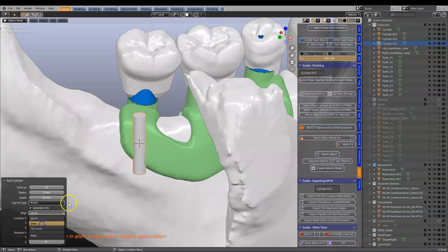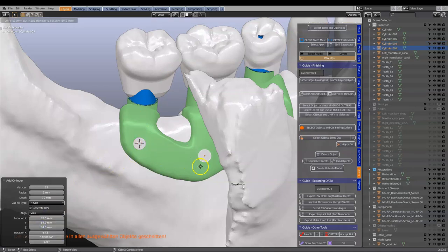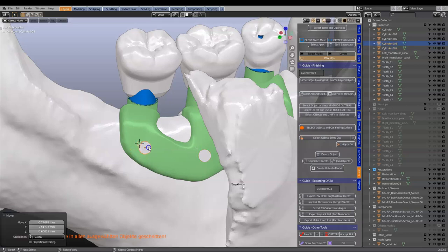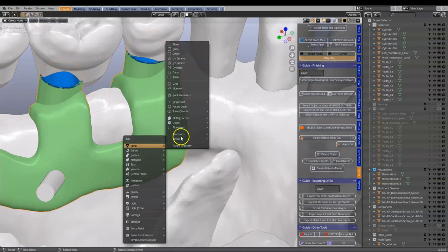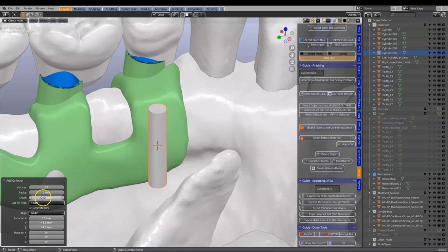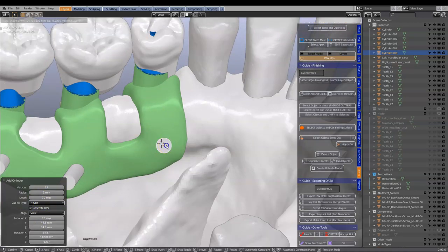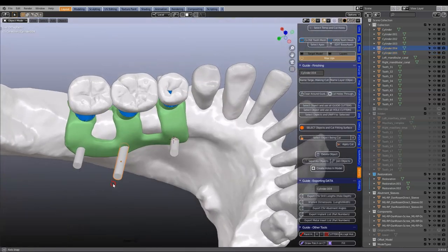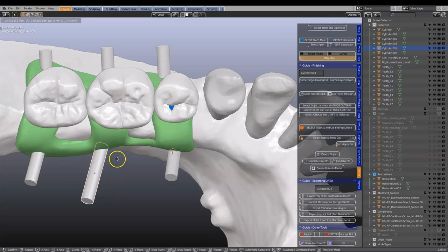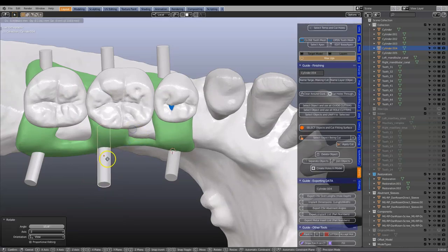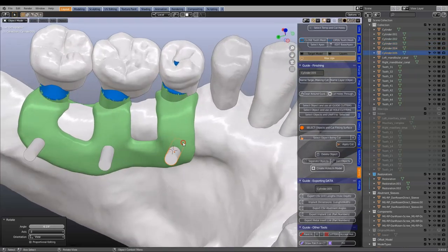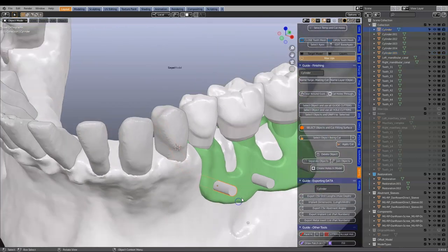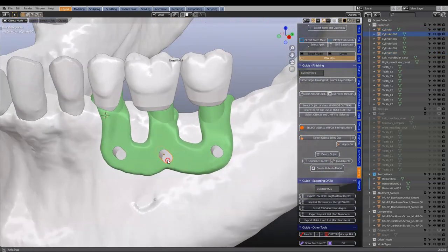I'll align each cylinder to the view, use Shift D to duplicate, and place one more on the other side. Using the G key and R key we can make sure the holes are exactly where they should be. This is again up to you where you put them and how thick the holes are going to be.